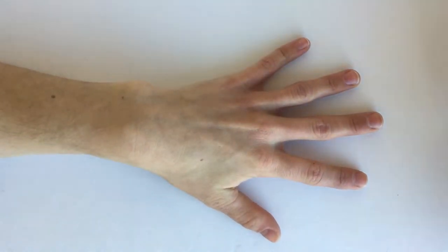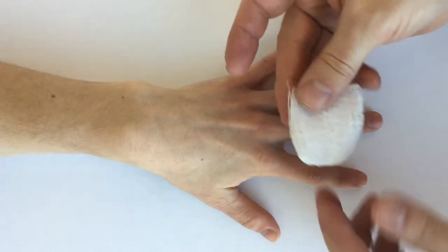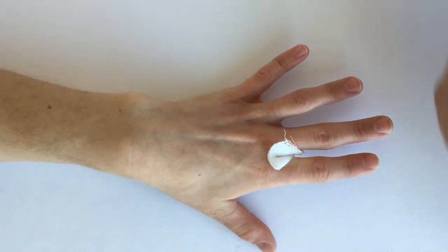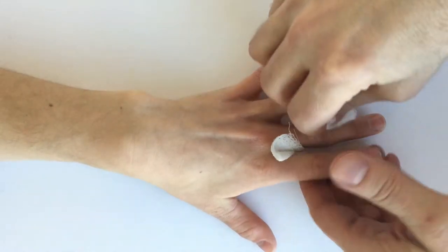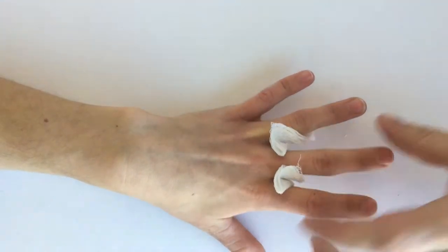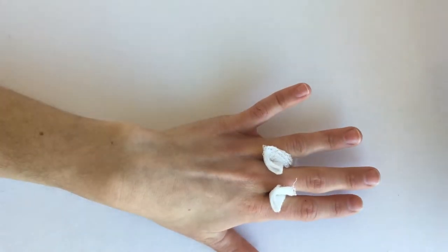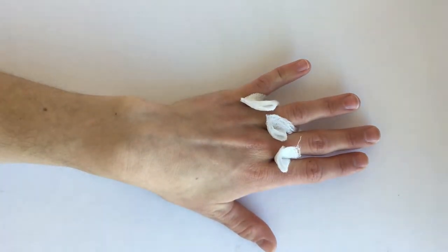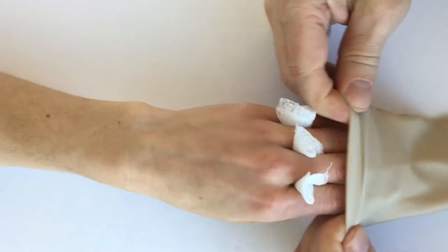One thing you can do is just take some gauze 2x2s and fold them over and put one in between each of the fingers, and then put the edema glove over that.